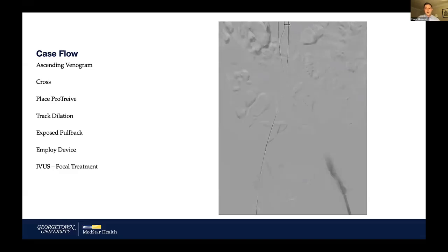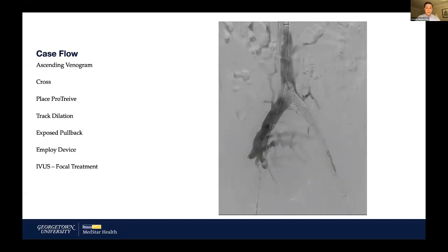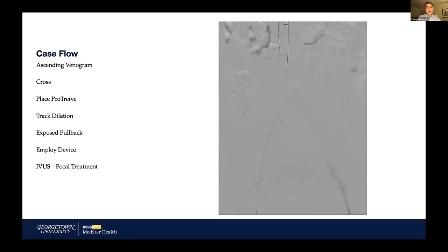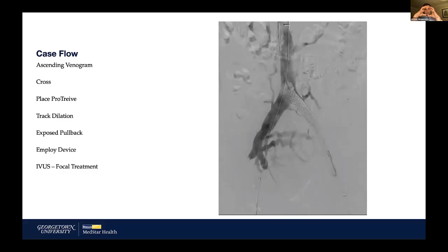We continued to work, and after about five to ten minutes of revving back and forth, we made really good progress in terms of lumen. At this point I performed intravascular ultrasound to see what type of material remained in the stent lumen and what areas needed focus. The venogram was helpful — near the caval confluence you can see a higher level of thrombotic material leading to stenosis, and it showed me I had to spend more time in the proximal inflow segment to address irregular material around the lumen.